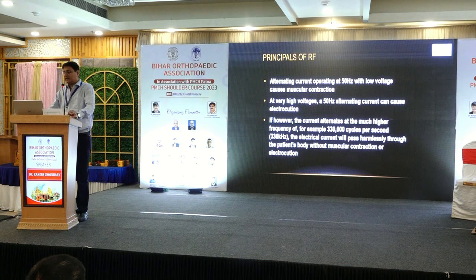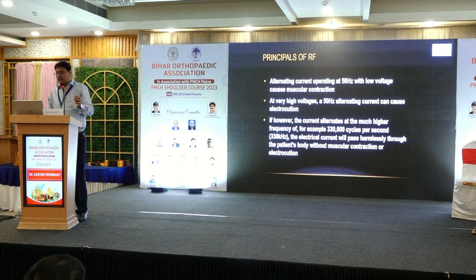But if the current at low voltage passes through at a very high frequency, 330 kilohertz, the electric current will pass through the body harmlessly. You won't even know the electric current is passing through your body.